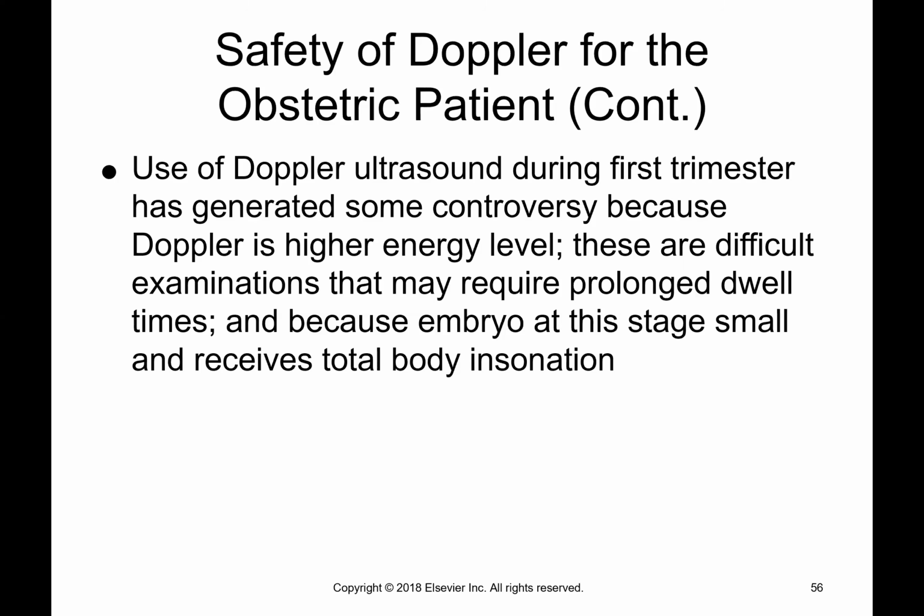A lot of patients want to hear the heart rate in the first trimester when you're scanning them, but when anybody asks me, I say I just don't like to put that pulse wave Doppler on a young baby in the first trimester while the heart's developing. And when I say that, all of them understand, because that's the most important thing. So that's just my 2 cents on that.